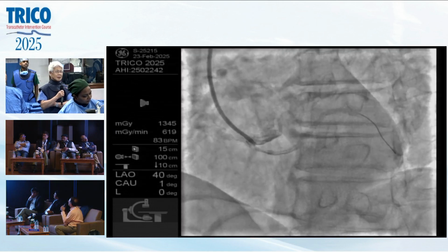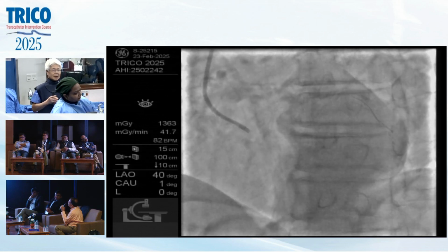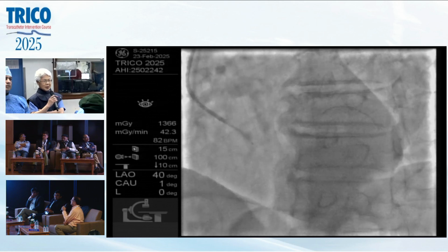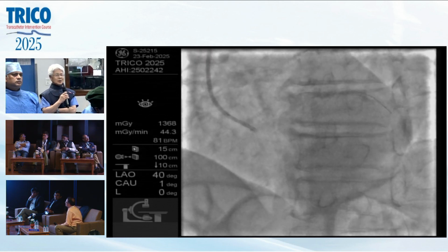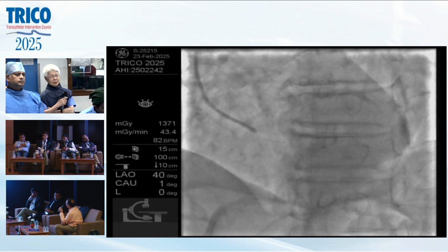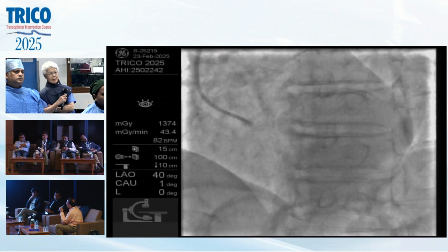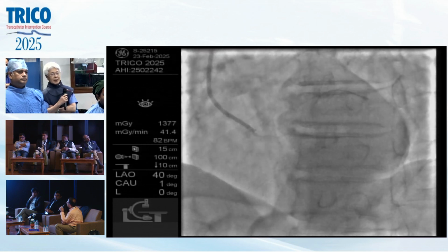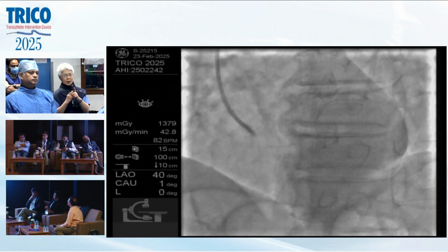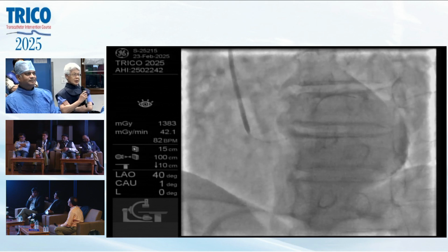Because I think, for the intramyocardial vessels, the media is a little different, isn't it? But I don't think so. No. Okay. Basically, yes. I never read anything, but I have heard comments from different people. It's good to know that there is no difference. You treat them like normal coronaries. This is good. This is the simple original anomalous, right? Therefore, the histology shows no difference.